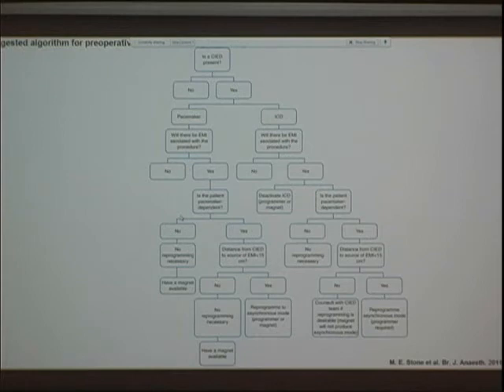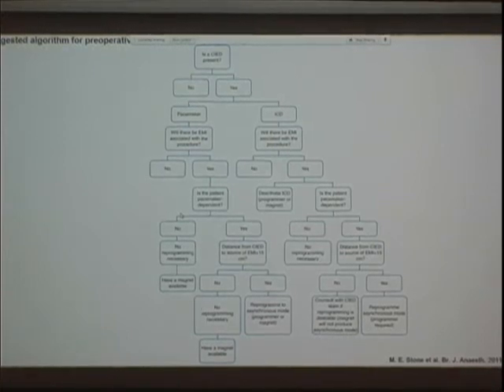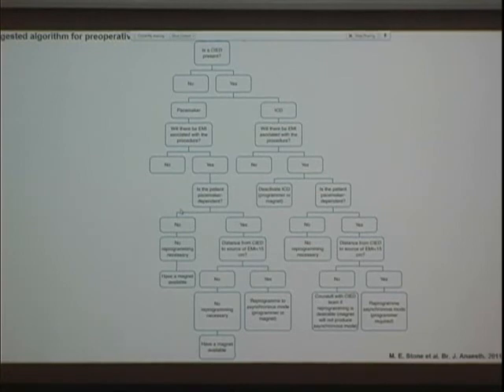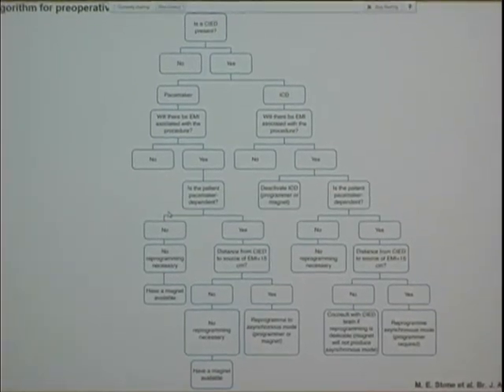If you do place a magnet, you can safely take it off at the end of the procedure and it does not require reprogramming. There are a subset of Boston Scientific defibrillators that needed to be manually programmed after a magnet was placed, but most of those have now lived their lives and have been replaced with newer models.